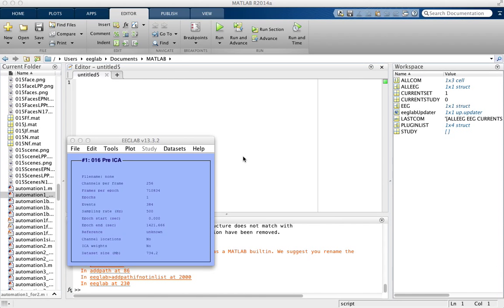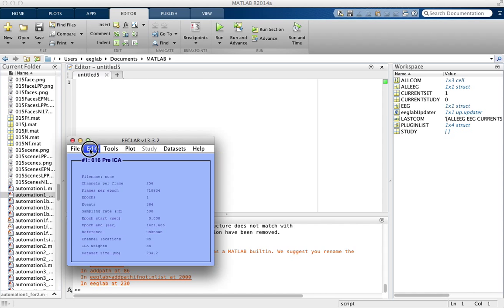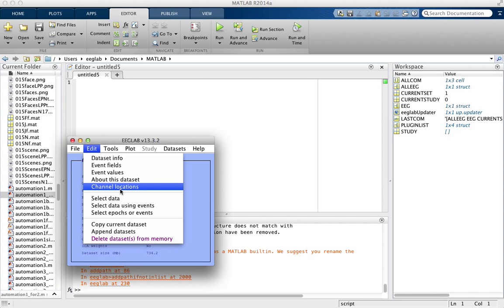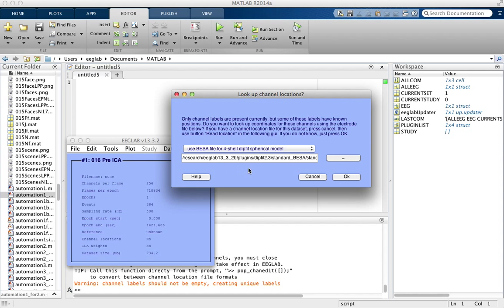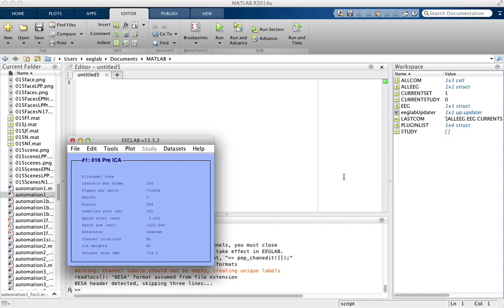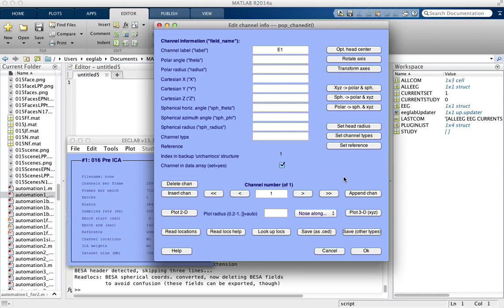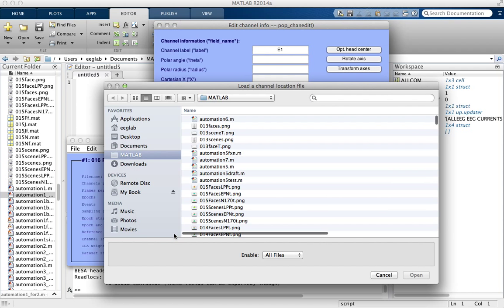This is how to set the channel locations in EEGLab. What you do is click Edit, then Channel Locations, click OK, and then this box will pop up with all the channel information. Then we're going to read locations from a file.